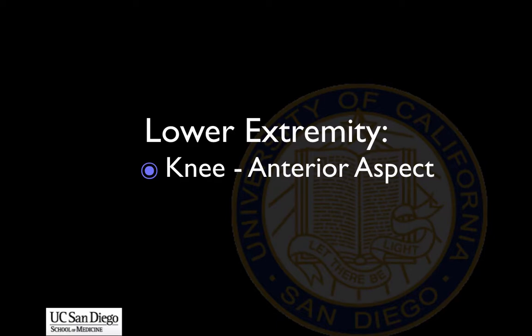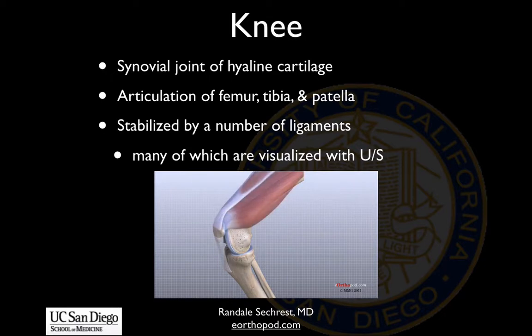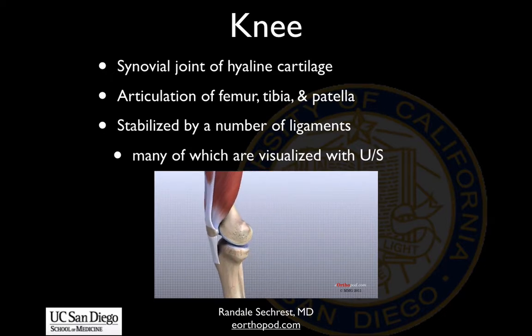Next, Dr. Medak will discuss ultrasonography of the anterior knee, followed by some examples of pathology. And now, let's focus our attention on the knee as we continue our discussion of musculoskeletal ultrasound.